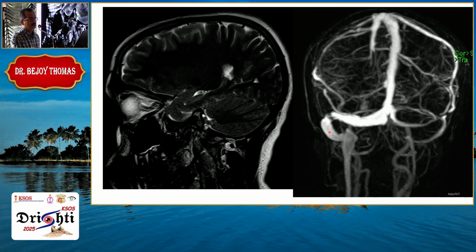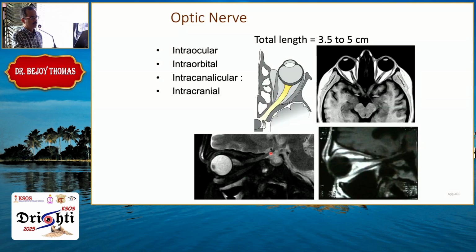Another very interesting thing is that as soon as you see this on an MRI, you will not go and do stenting, because raised ICP itself can produce a narrowing, especially the posterior part of the superior sagittal sinus, with side to side flattening as well as narrowing here. So you have to see whether this is a physiological narrowing, or whether it is a chicken or egg situation. So you have to make the pressure measurement through the transvenous microcatheter, and then only you can think of it. Otherwise, the treatment is doing a CSF shunting, either thecoperitoneal shunting, as well as continuing with the medical management.